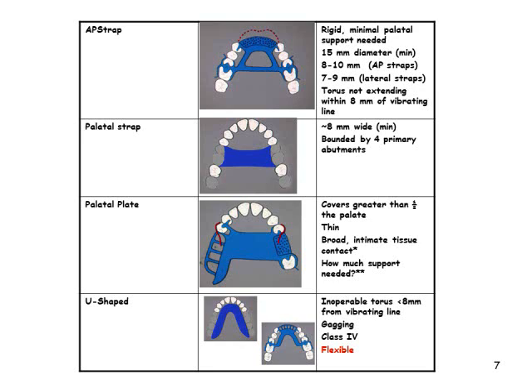The U-shaped palatal major connector. This connector should be used only in those situations where inoperable tori extend to the posterior limit of the hard palate. Severe gaggers may also be considered, as well as certain Class IV designs. The U-shaped palatal major connector is probably the poorest design of all palatal major connectors, because it lacks the rigidity of other types of connectors.